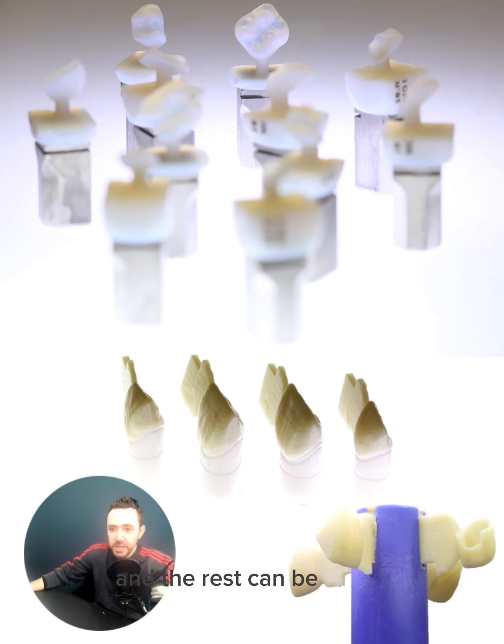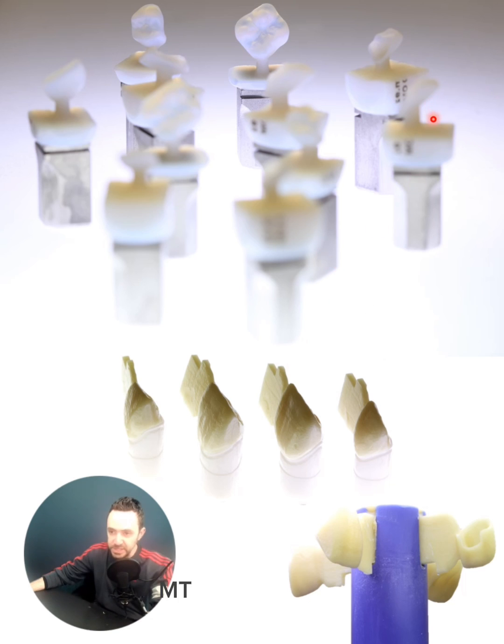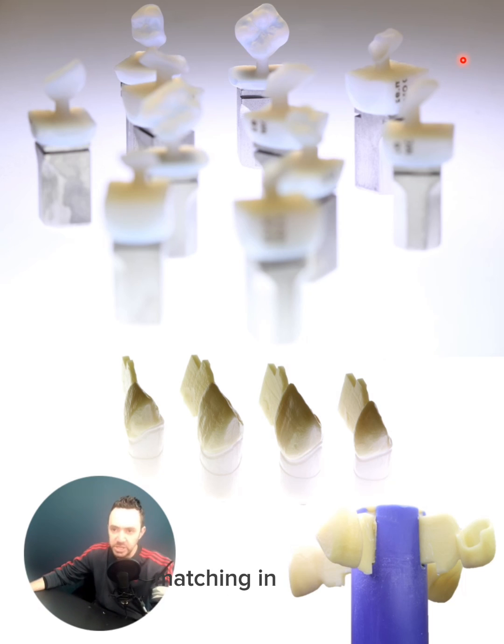The rest can be either pressed or milled out of MT or LT. What I did in this case — I did just the front centrals and laterals using the multi-press, and the canine, premolar, and molar using the Emax CAD material, MT. The same shade will be picked for the multi-press, and you'll definitely have a perfect matching in shade dimension.